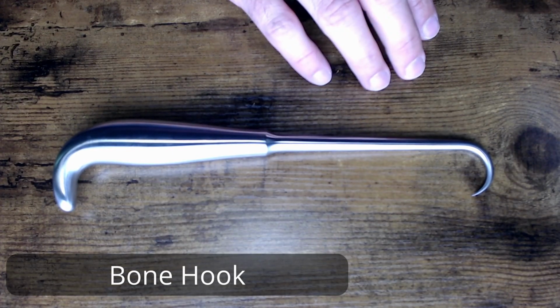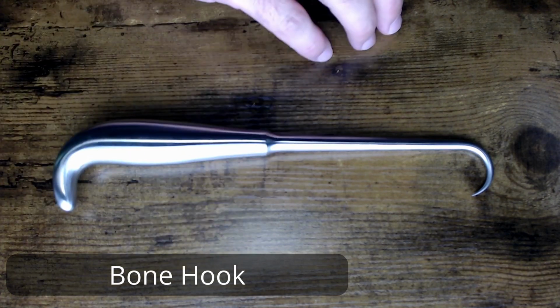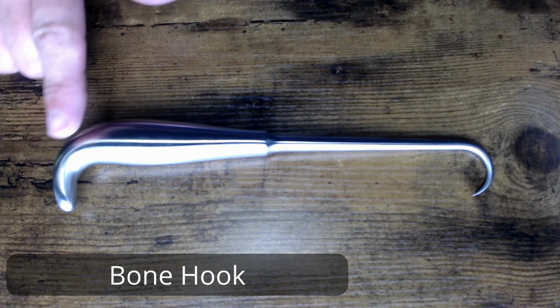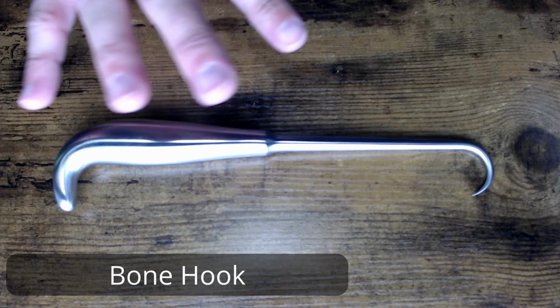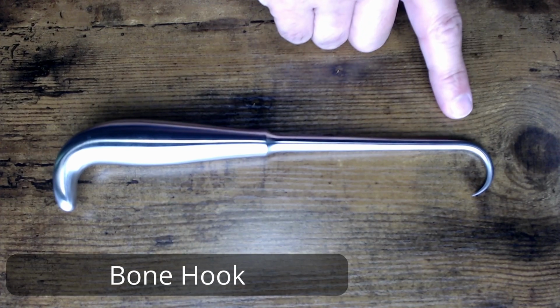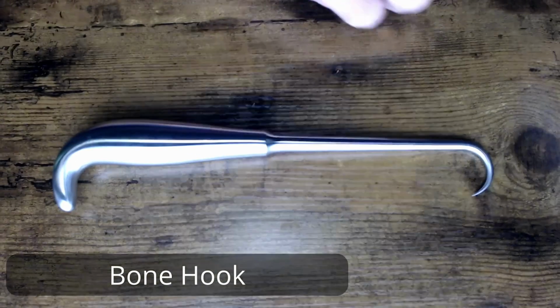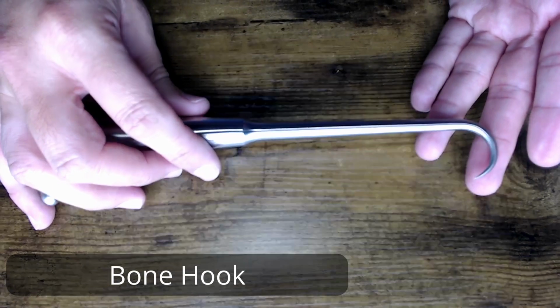In inspecting it, because there's no complex part of the instrument, there's no hinge, there's no articulation going on here, the primary inspection is that there's no residue on the handle. Many times in these orthopedic instruments, you will see some kind of sticky residue. Just make sure none of that's there. Sometimes you'll see some cement, etc. Keep an eye out for that. And then on your tip, you're just going to want to make sure that it's got that natural angle and curve there in the bone hook. And if it's a sharp hook, you want to make sure that it's still sharp on that end and that it's not turned or bent any direction through the reprocessing cycle, right?